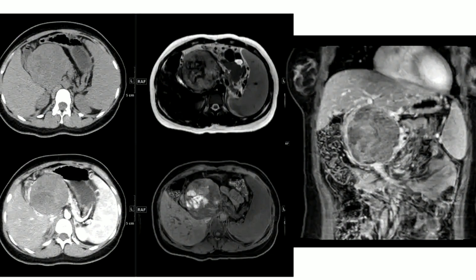We have CT and MR available. The first two images are from CT scan — the first is a plain study and the second is an arterial phase contrast scan of the abdomen at the level of the liver. I can appreciate a large, well-circumscribed hypodense lesion in the region of the head of the pancreas showing no internal air, no fluid content, no calcifications, and no central scar. The parenchyma of the body and tail of the pancreas is enhancing and appears normal, with no peripancreatic fat changes visualized.